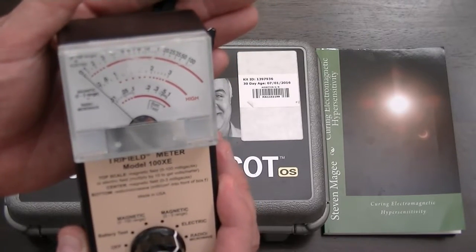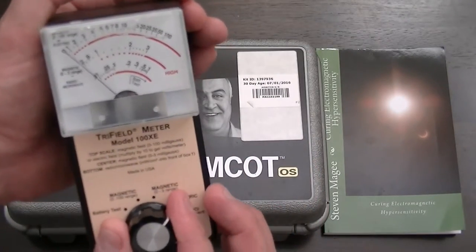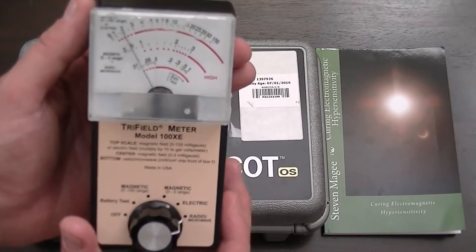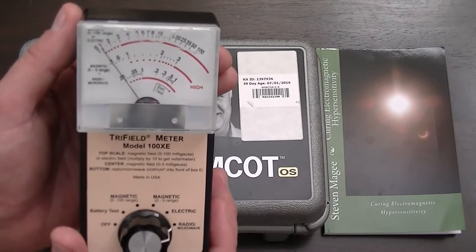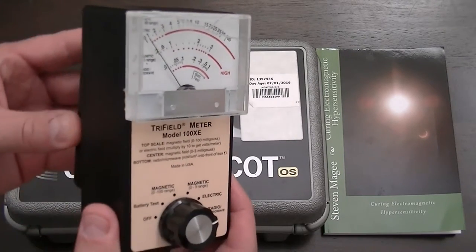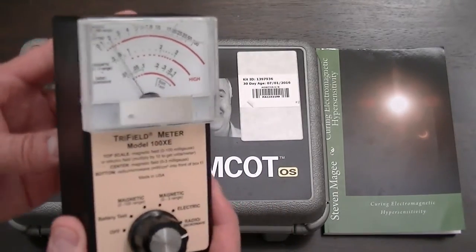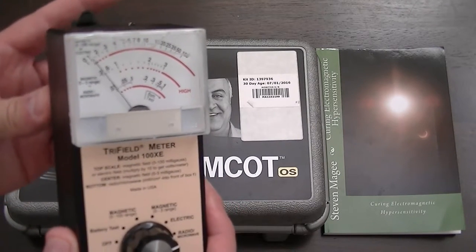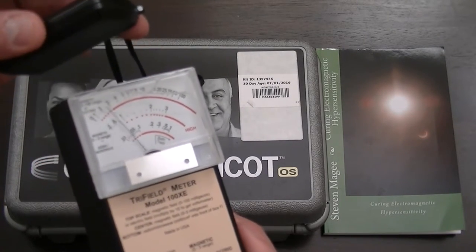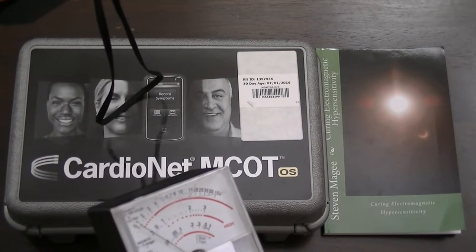Pulsating electromagnetic field right there. Our last setting is radio and microwave. Let's see what happens when we switch over to radio and microwave. We're definitely picking up a field on the radio and microwave setting as well. It's not a very big field, but when it's right next to the meter, the meter is definitely picking it up. And again, it goes quite some distance.